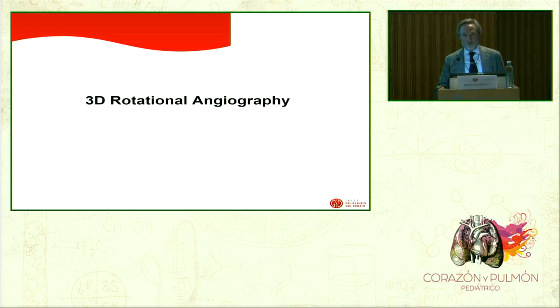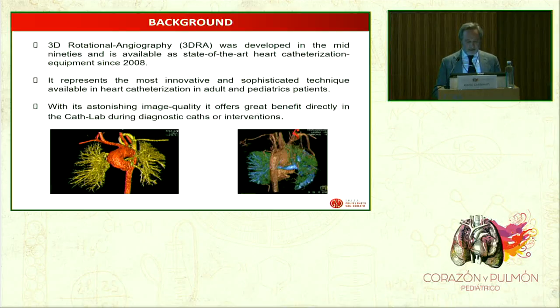First of all, I'd like to introduce immediately the technique that we started to use approximately 4 years ago, the 3D rotational angiography. This technique was developed some years ago, but became, let's say, very popular only recently, 3 or 4 years ago. It is a very innovative and sophisticated technique in the cardiac catheterization lab, particularly for complex cases.